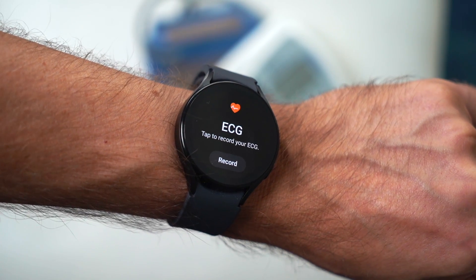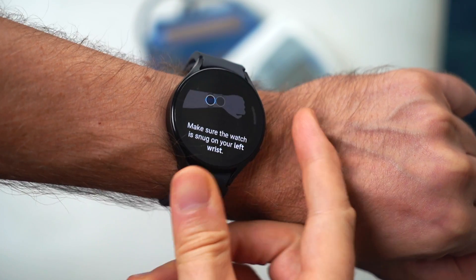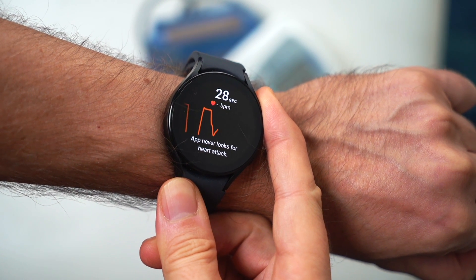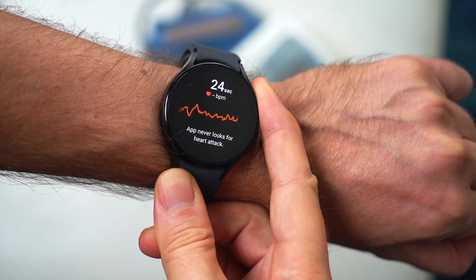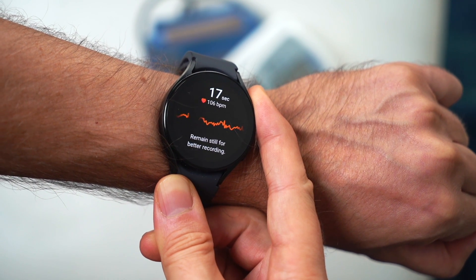Once you're set up, getting an ECG reading is very easy. You'll notice how I'm doing it here. The reading requires you to be still — I tried to film this in a way where I could be very still, but it was not easy and I didn't have anybody to help me. Basically the idea is you've got to be still and it'll take a little bit to take a good reading. But once it does, after about 30 seconds, it takes a reading and then you'll see basically where you stand.